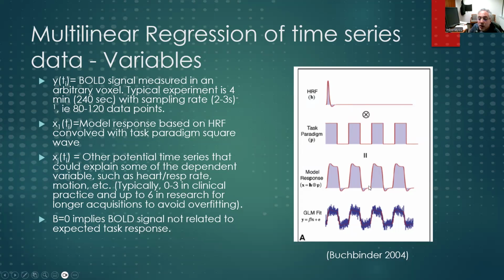Here at Wake, I read all the fMRIs, but most of my colleagues around the country doing fMRI who are clinicians only have super easy user-friendly software where all of this is kept away. The HRF is in the software somewhere and it's not even changeable. So if you did a baby and you didn't think the HRF was appropriate, you'd have no way in this user-friendly clinical software to go in and change it.